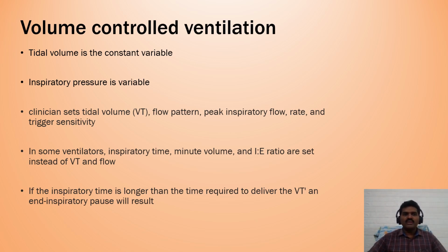Clinician sets tidal volume, flow pattern, peak inspiratory flow, respiratory rate, and the trigger sensitivity. In some ventilators, inspiratory time, minute ventilation, and IE ratio are set instead of VT and flow. If the inspiratory time is longer, the time required to deliver the VT and an end inspiratory pause will result.